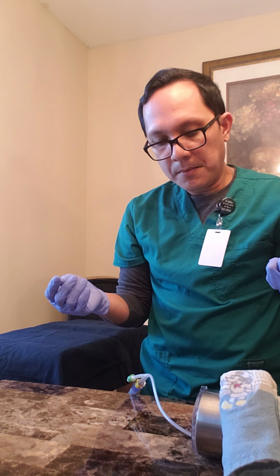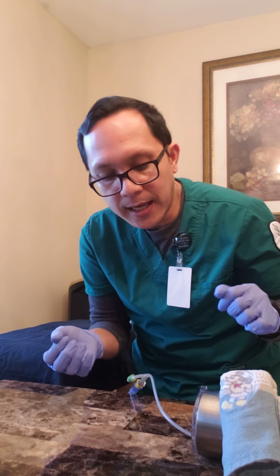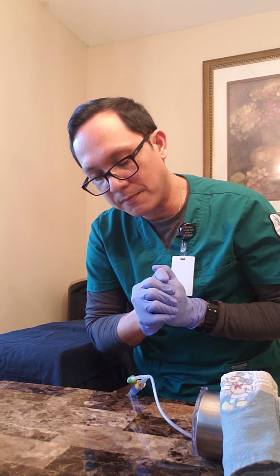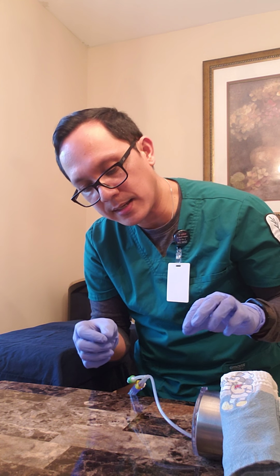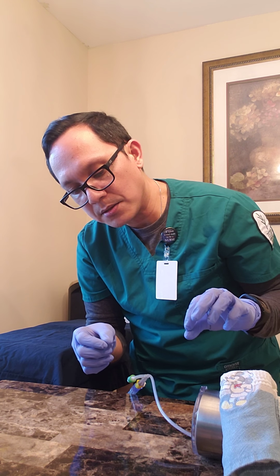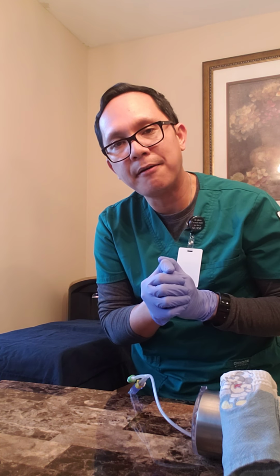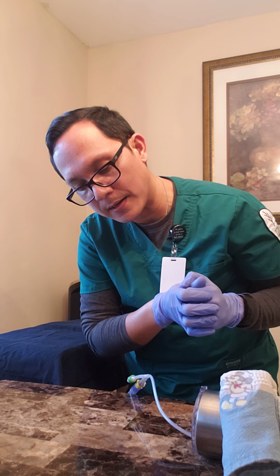Okay, now I'm going to assess the skin of the perineal area where we inserted the Foley, just to make sure there are no signs of skin breakdown, there's no redness, and there are no signs of infection starting.